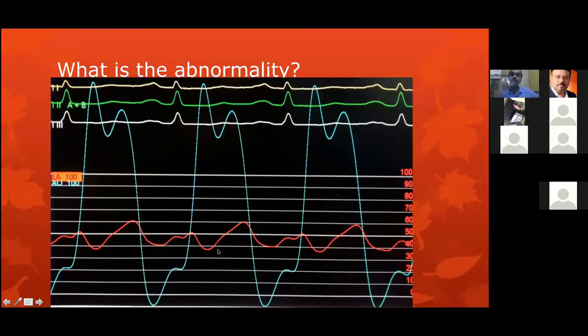left atrium. The basic rule of tricuspid and mitral stenosis is that the A wave should become tall. But on the right side, the A wave will always be taller. On the left side, the A wave will remain taller in the earliest, mild mitral stenosis. The moment the mitral stenosis increases beyond a particular point, when the LA pressure shoots beyond a particular point, the A wave cannot compensate further. So then the V wave increases progressively. Elevation of the V wave is an indicator that left atrial compliance is low.